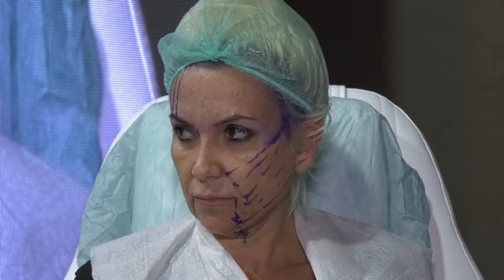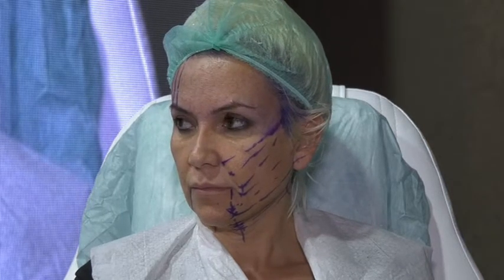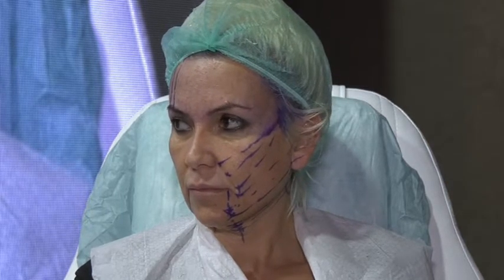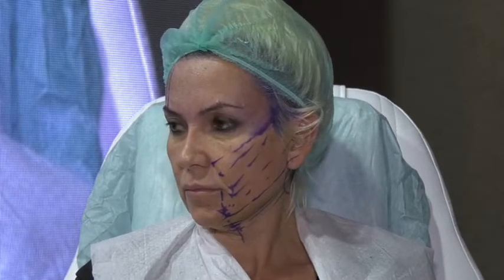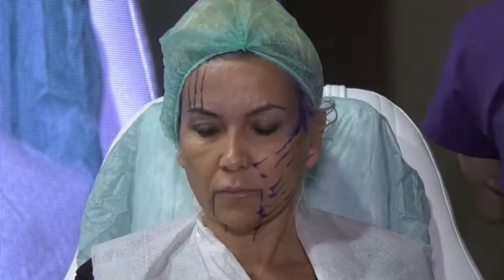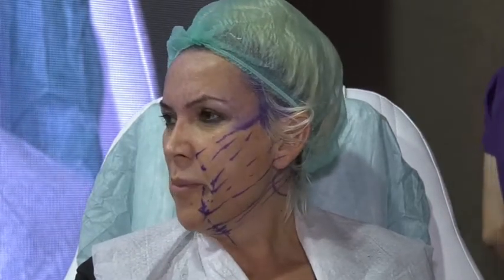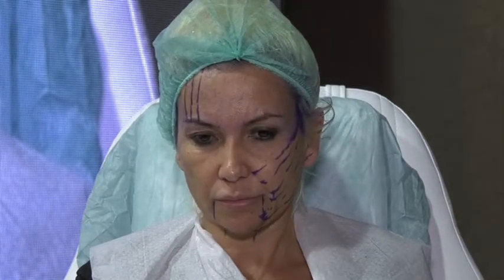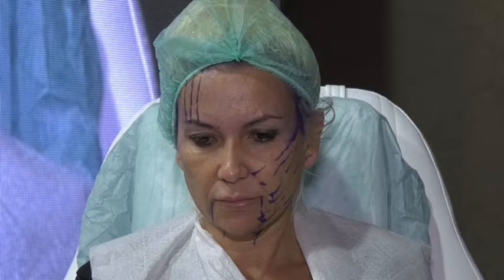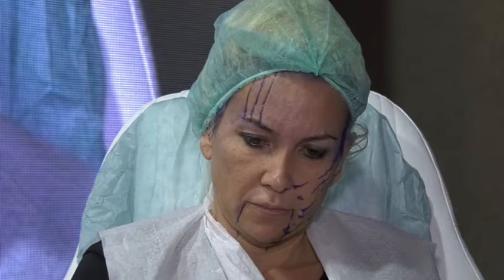Any other question, or can we go to the nose marking? Okay, we'll go to the nose marking. The nose marking, you know that this nose is not designed for the Asian nose. Of course all the techniques you are seeing now are mine, but especially this one, I'm so proud of it, because usually it has a very beautiful result that most people don't believe it's threads.